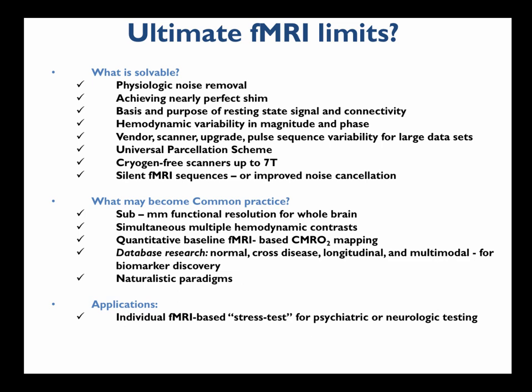And then finally, applications. I believe we'll have, at least clinically, a lot of clinical applications, maybe for localizing function for neuromodulation or whatever, but also individual fMRI-based stress tests. So you put a subject in a scanner, you have them watch a movie, you look at their activation, compare it to a template of dynamics, and then you're able to say you might have this disease in the future, or you might benefit from this medication right now. The type of movie would be something that might induce anxiety or emotions of some sort, but that will be a sort of stress test.